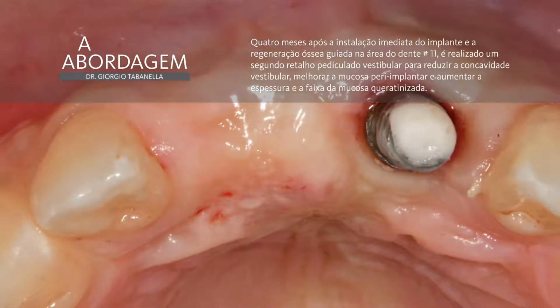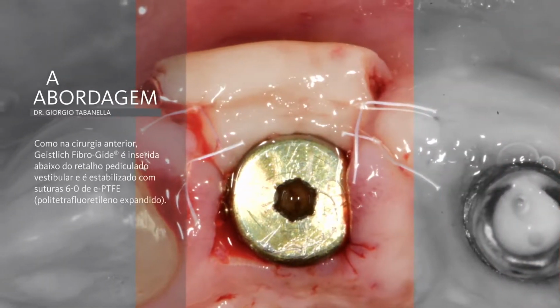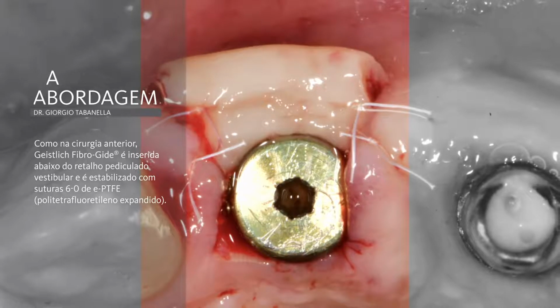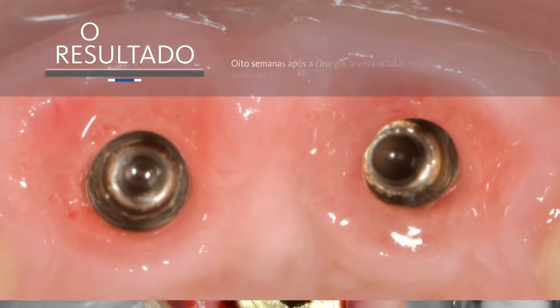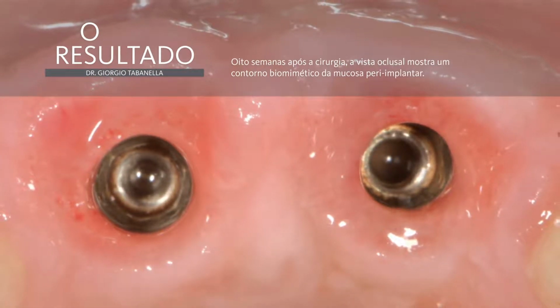We're going to extract number 11 and of course the implant is being placed. So now we're performing a second buccal pedicle flap on area number 11 with the use also of Fibro-Gide, and again I'm going to use monofilament sutures. This is the result after both buccal pedicle flaps, 8 weeks after, allowing the tissue to mature properly.